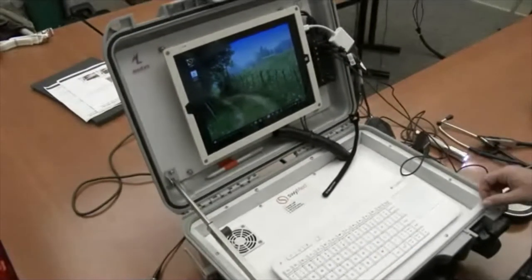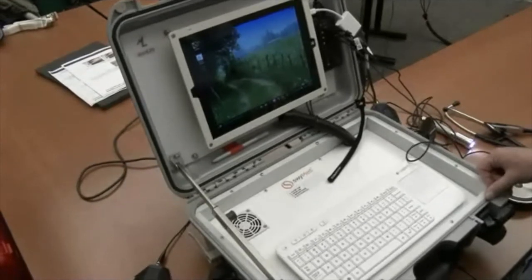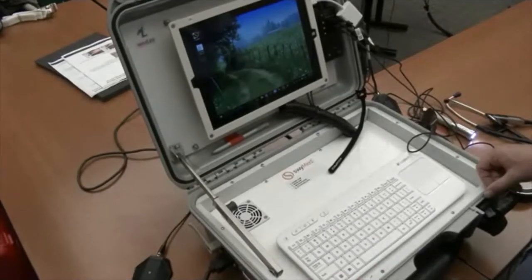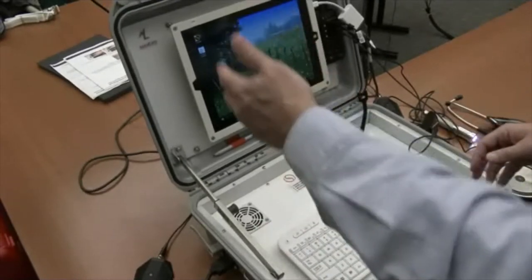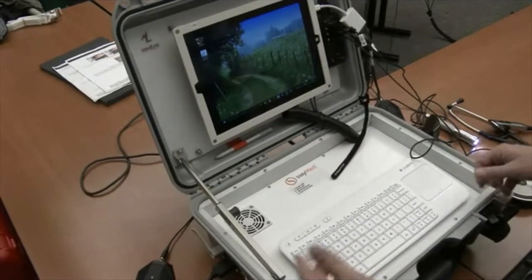Start by turning on the tablet that is here. Once the tablet is on, it takes five minutes before it connects and everything is ready to go. So the first thing you should do is turn it on and make sure that it starts connecting.